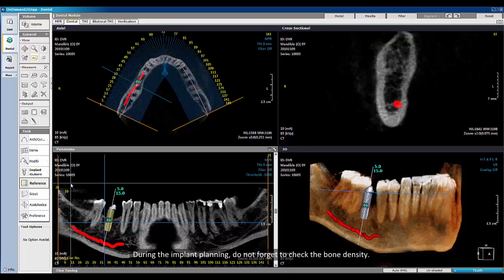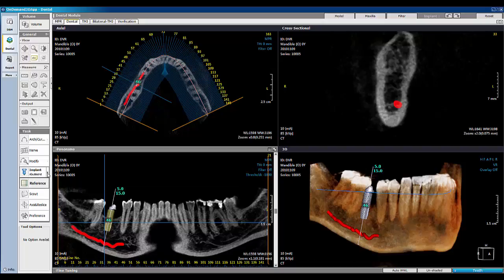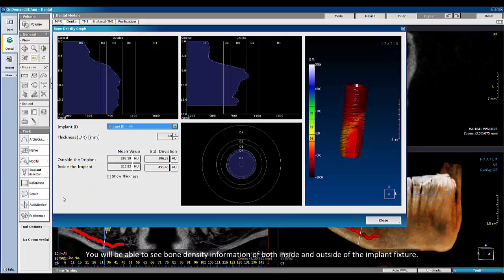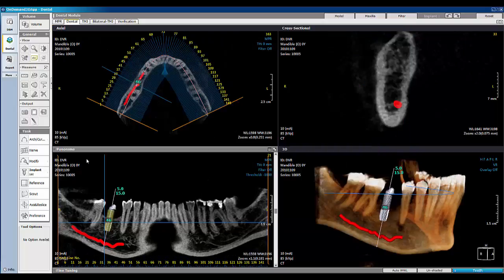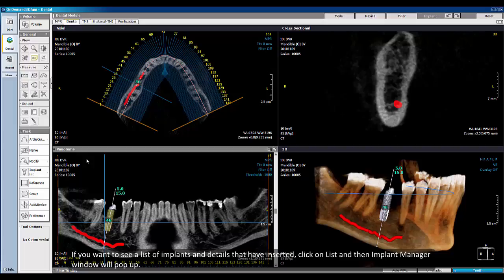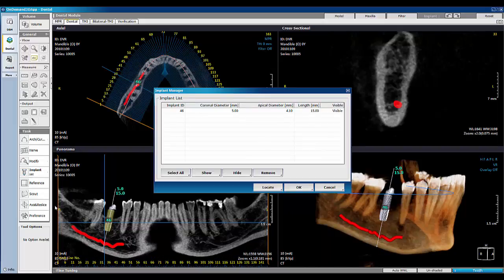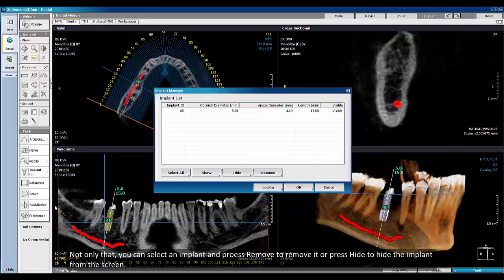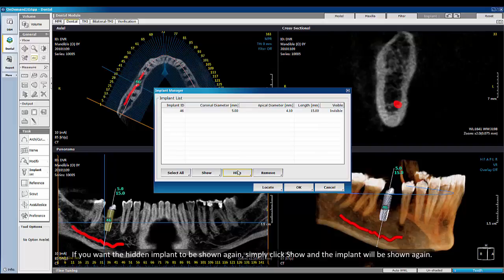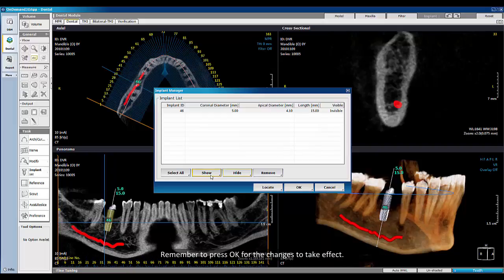During implant planning, do not forget to check the bone density. Click Bone Density, which provides graphs on the bone density information for each implant. You will be able to see bone density information for both inside and outside of the implant fixture. If you want to see a list of implants and details that have been inserted, click on List and the Implant Manager window will pop up. You can select an implant and press Remove to remove it, or press Hide to hide the implant from the screen. If you want the hidden implant to be shown again, simply click Show and it will reappear. Remember to press OK for the changes to take effect.